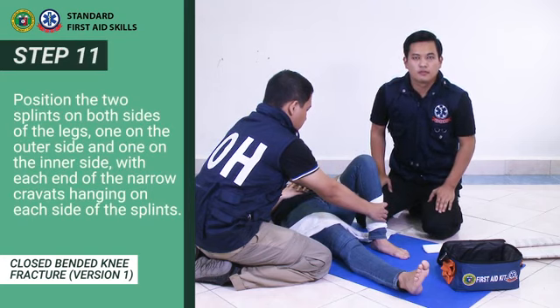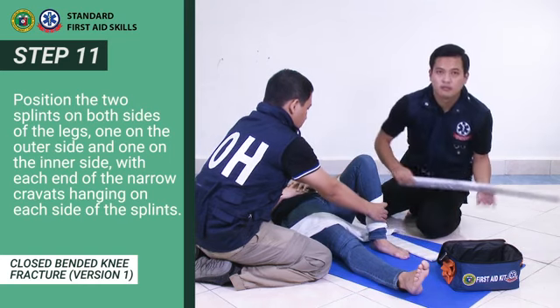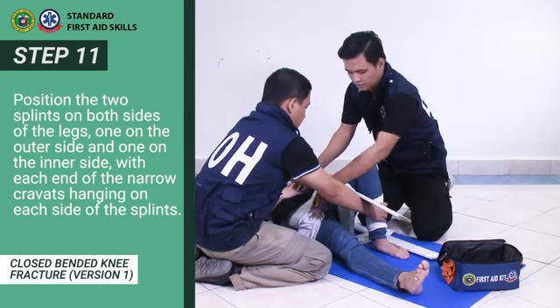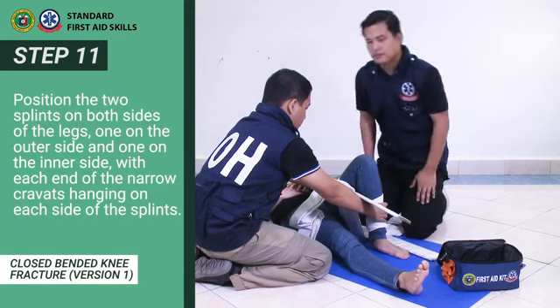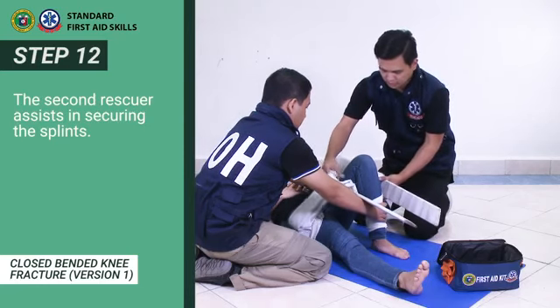Step 10/11: Position the two splints on both sides of the leg, one on the inner side, with each end of the narrow cravats hanging on each side of the splints. The second rescuer assists in securing the splints.